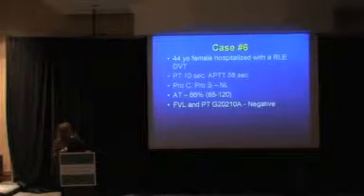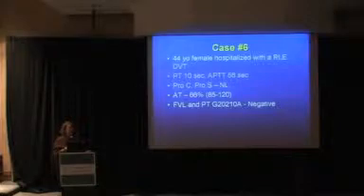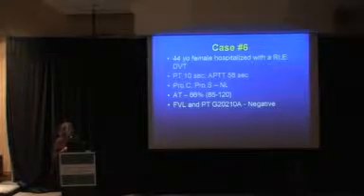Well, here she is hospitalized with a DVT and her PTT is 58 seconds. So the first thing I think about, because if we get a sample from a hospitalized patient with a high PTT, it's guilty until proven innocent, I think. So it's heparin until you prove otherwise.